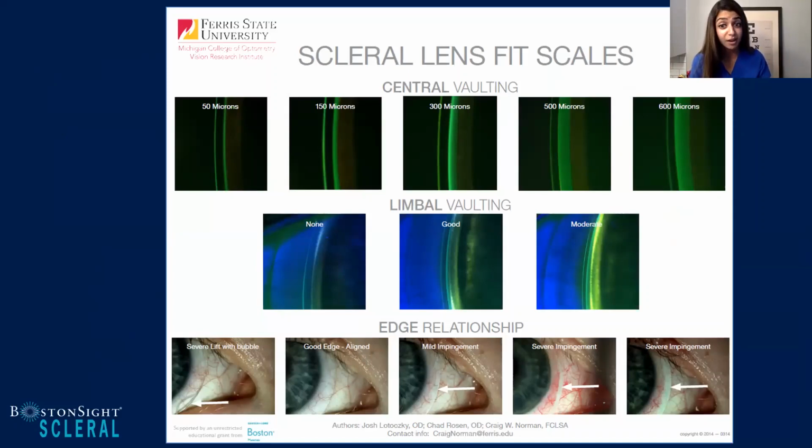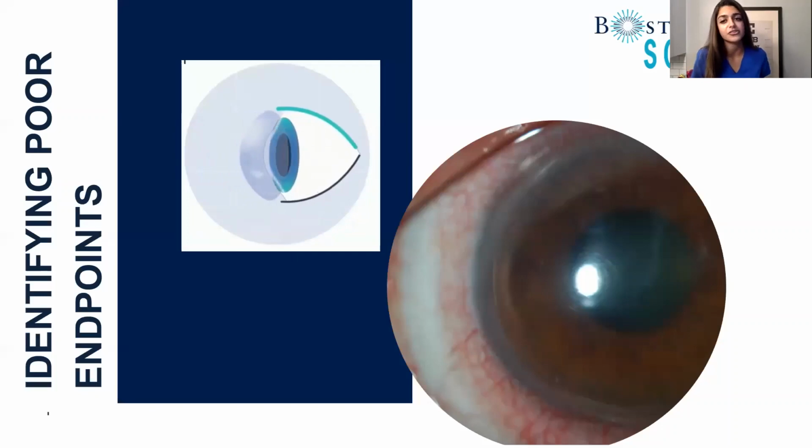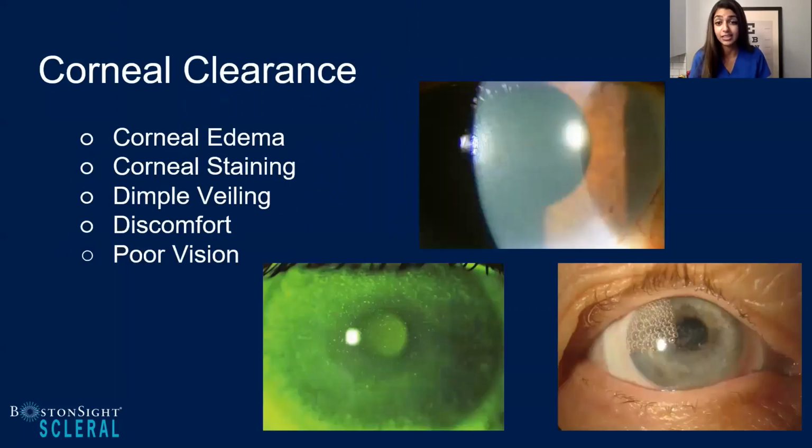So, Shalu, we've now understood the fundamentals of scleral lenses as far as the fitting 101. Now let's start understanding each zone and determining when you end up at a point where you might have a complication based off of each zone. So when we first think of our central clearance zone, what we're thinking about is either you have too much or you don't have enough. So there's a big discussion, and this is probably a lecture for another day, of corneal edema and how much is actually inducing corneal edema.